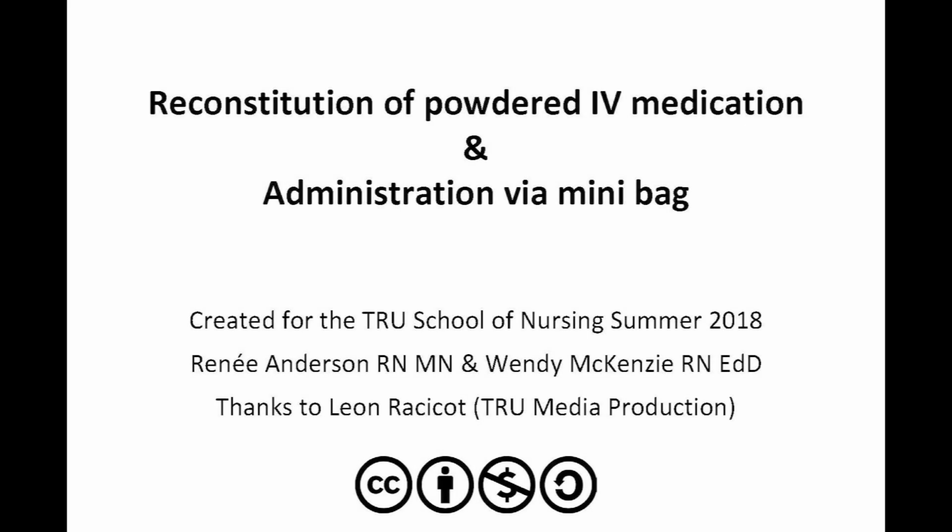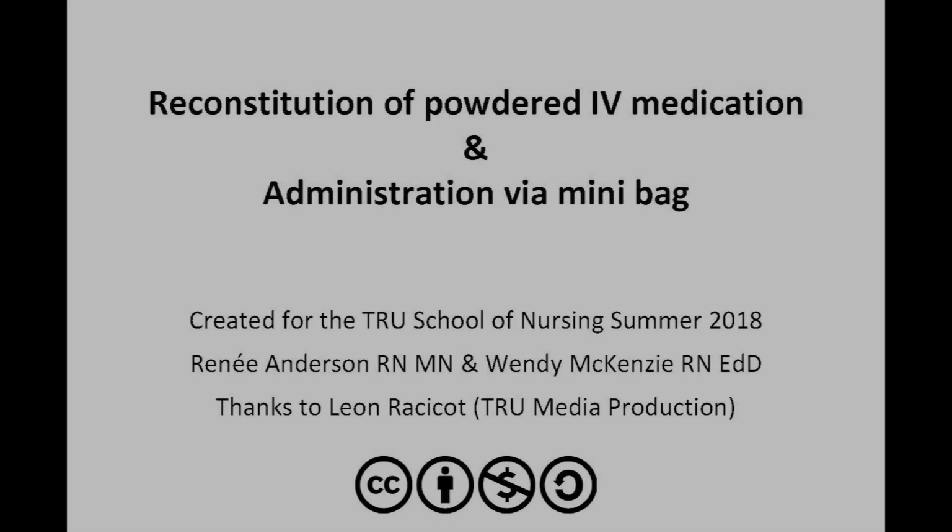Hello everyone, today here's Arin Usama and this video will speak about the reconstitution of powdered IV medication and the administration via the mini bag.